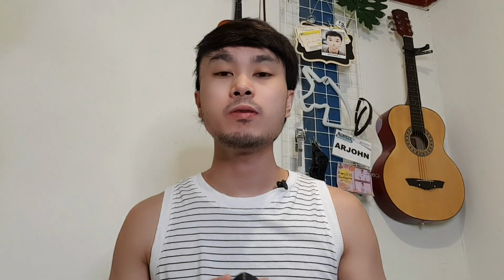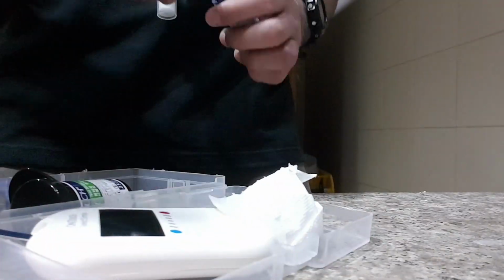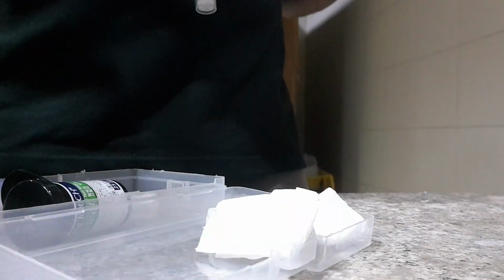Alright guys, so I'm back, but before we do some testing, let's compare muna yung dalawang device natin, the traditional glucometer and the CGM. So let's first discuss the price. For the price, mas cheaper yung budget natin dito, unlike sa sensor na mas pricey at kailangan i-order pa online. But with CGM guys, kahit naglalakad ka lang sa daan or kahit nasa jeep ka, you can just scan the sensor anytime, anywhere, at malalaman mo na kaagad yung current blood sugar level mo. I've been using CGM for 2 days, and I find it easy, convenient, and efficient to use, lalo na kapag nasa trabaho ako, unlike sa traditional glucometer device. Kailangan ko pang pumunta ng CR to prick my finger to test my blood sugar level.